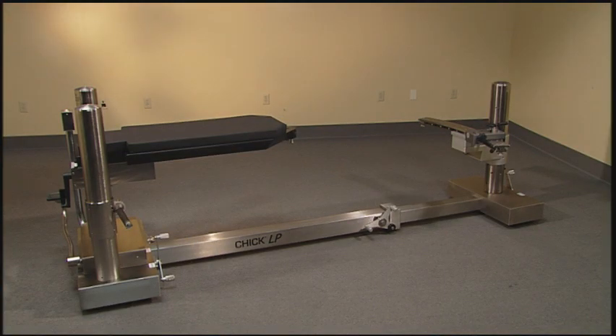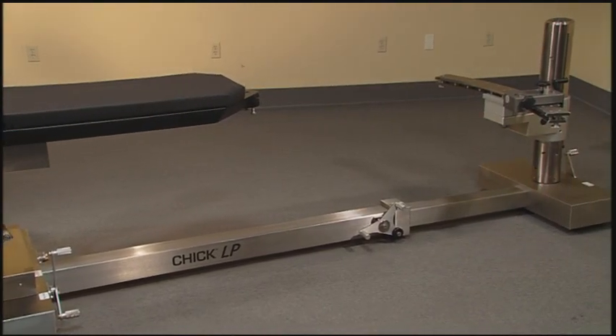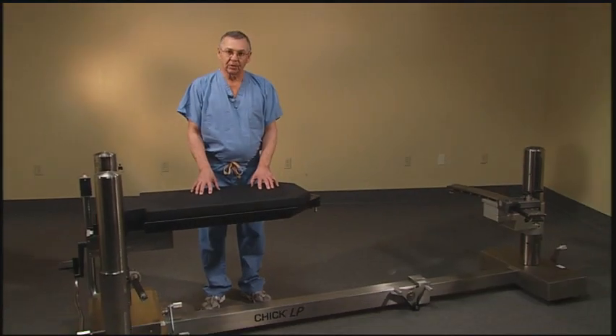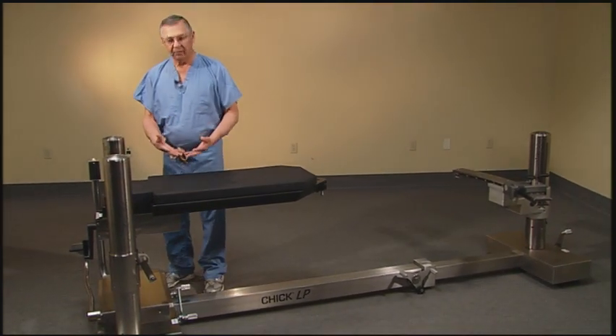Thank you for your interest in the CHICK Low Profile Orthopedic Fracture Table. We've been manufacturing CHICK tables for over 40 years. This is the latest version of our table, and we've made some enhancements that will improve surgeon performance.